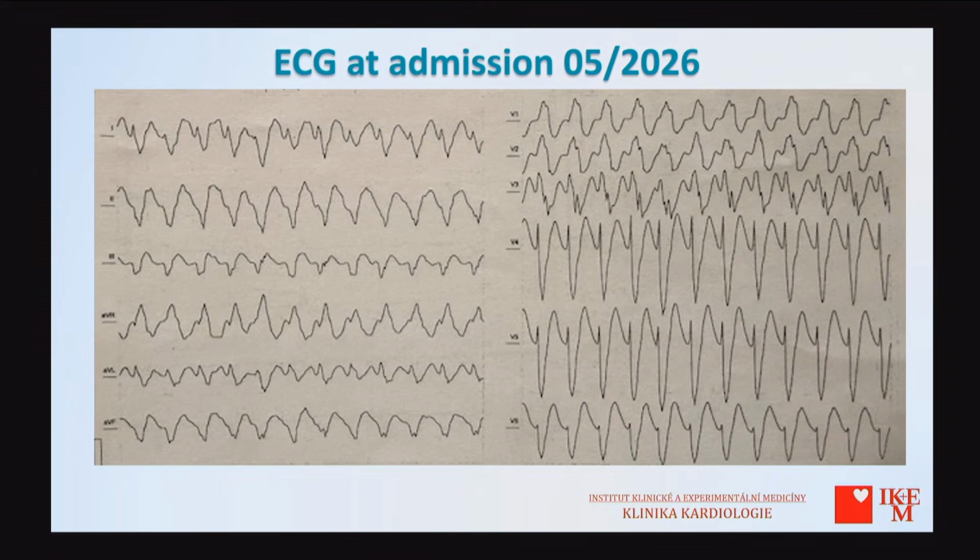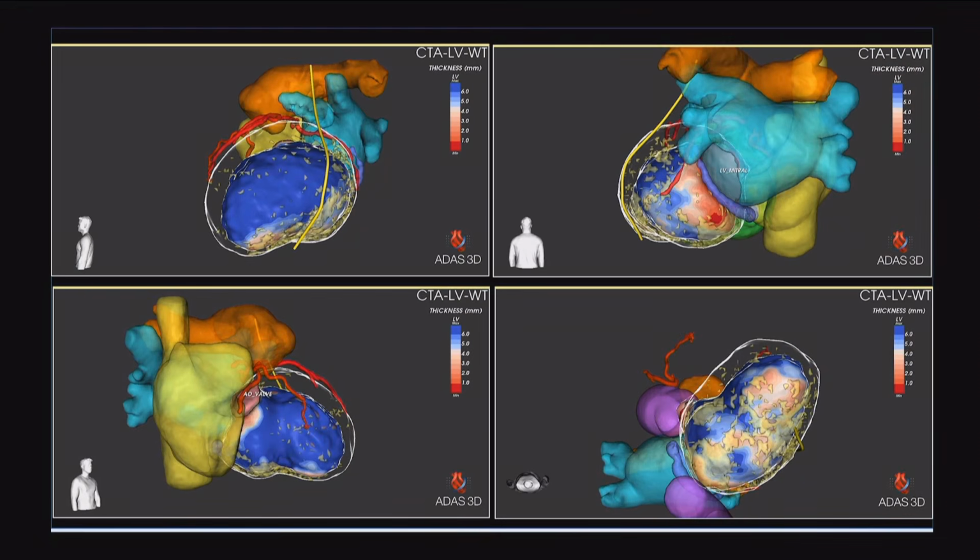And then we started the case. We are using general anesthesia. We have an NSIDE system, and we also have body surface mapping and CT. If I can just move to the next slide, maybe if Ivo wants to comment on this, I will give the word to Ivo.